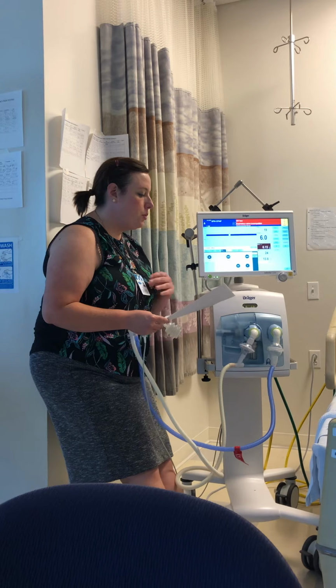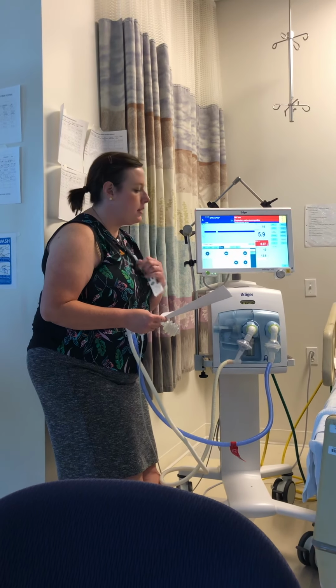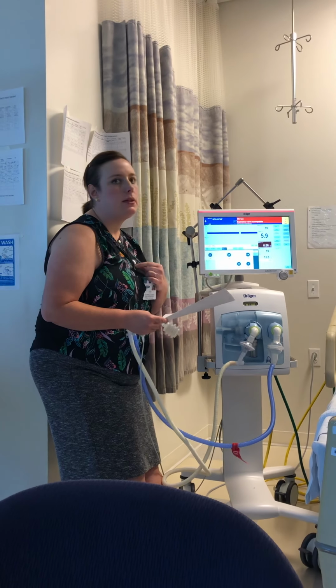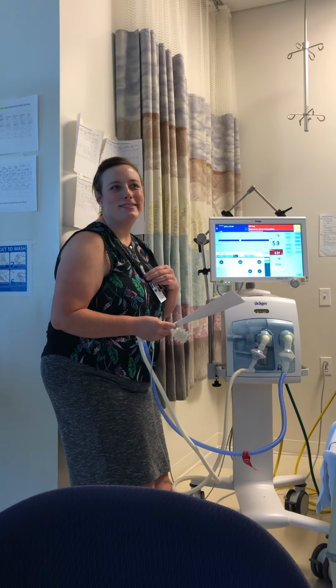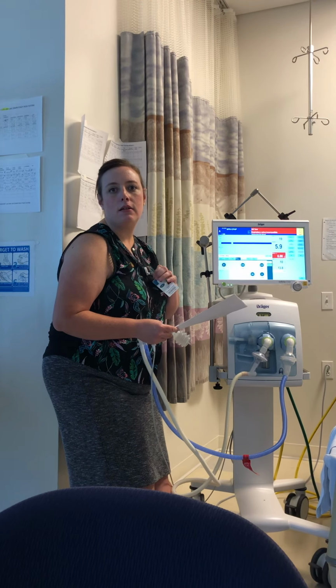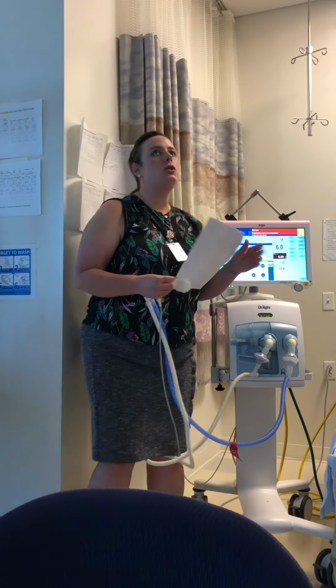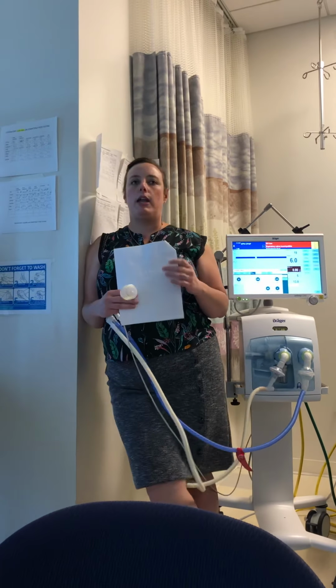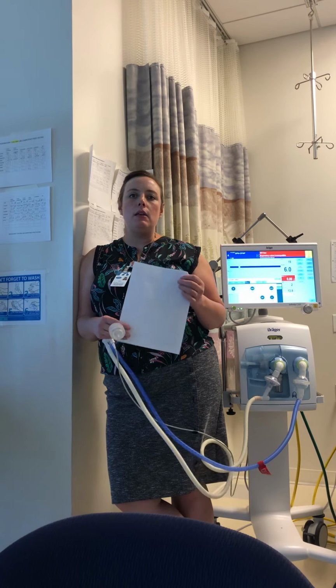Then we're going to wash our hands and record any relevant data in the patient chart and provide any suggestions. What do you think suggestions might be in this non-invasive ventilation mode? Periodically check the skin for breakdown. Sure, the suggestion might be using specific things to help protect the skin.